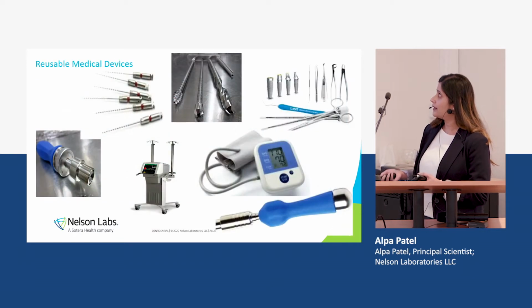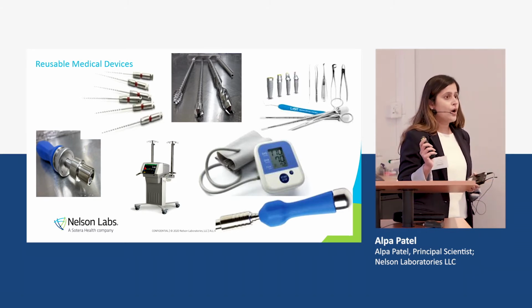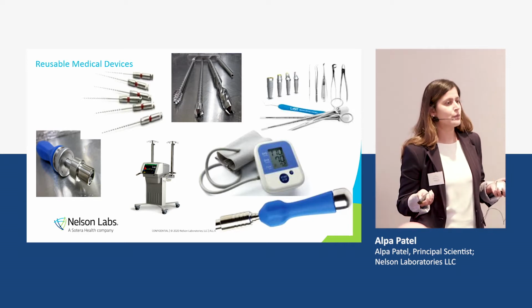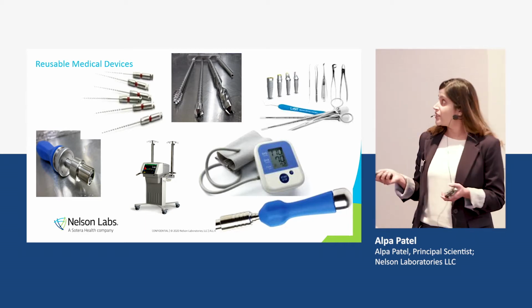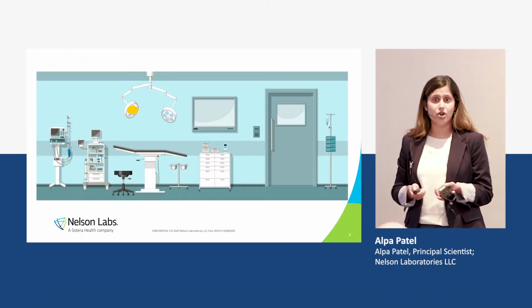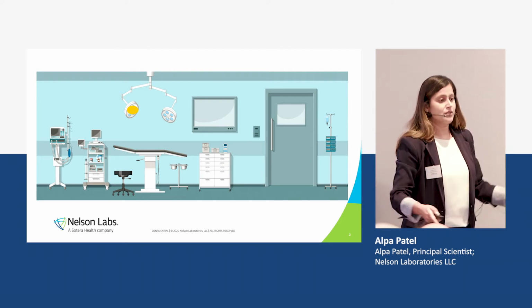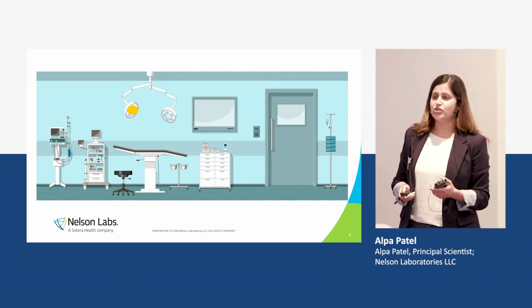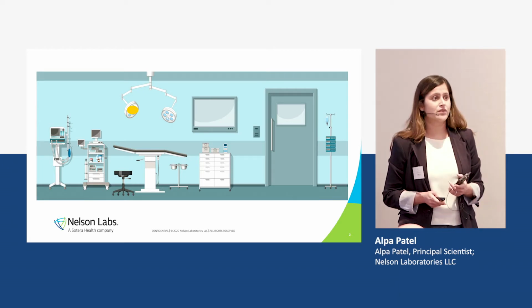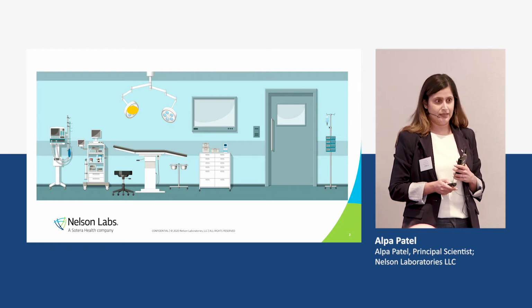Okay, so these are some of the devices that we encounter with reusable medical devices. When I talk about reusable medical devices, a lot of people think that these are surgical trays or endoscopes or things that are invasive. But usually they are things that are in the OR room. Surgical lights, believe it or not, we've validated a surgical light as half of this table is, right? Because if you're in procedure, if you cut open somebody and the blood splatters up there, how can you assure that that's clean and it will not cause cross-contamination, right?